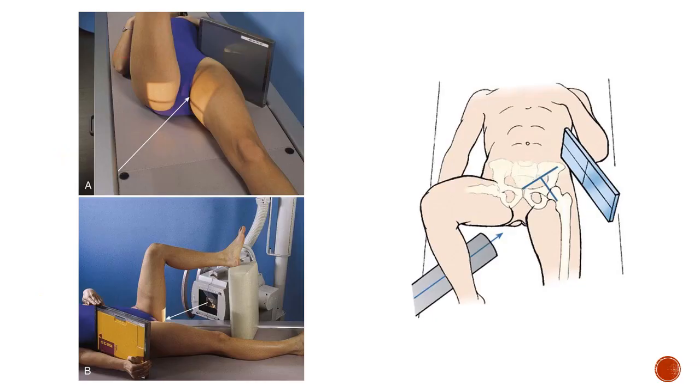And here's an image just showing that we're going to be centering to the groin area. We're going to have the unaffected leg up, the affected side is going to be down, and we're going to center perpendicular to the femoral neck. That image receptor should be at approximately a 45-degree angle to the lower extremity, to the femur.